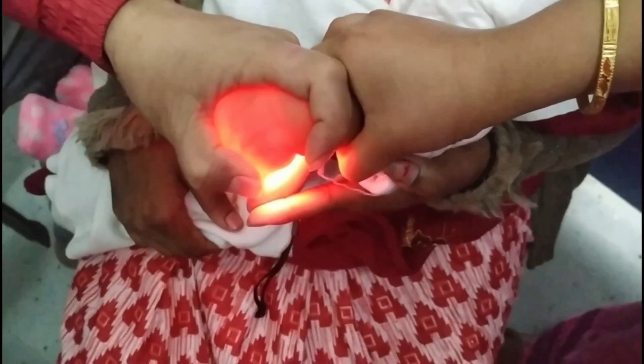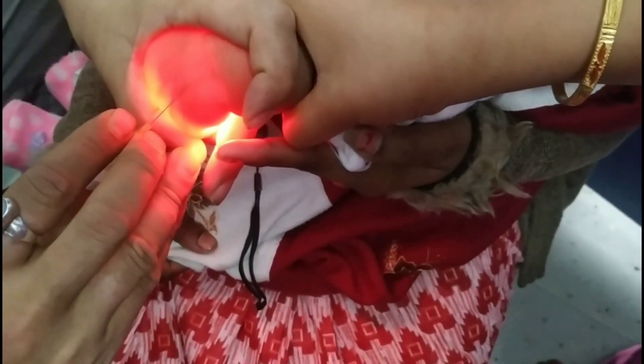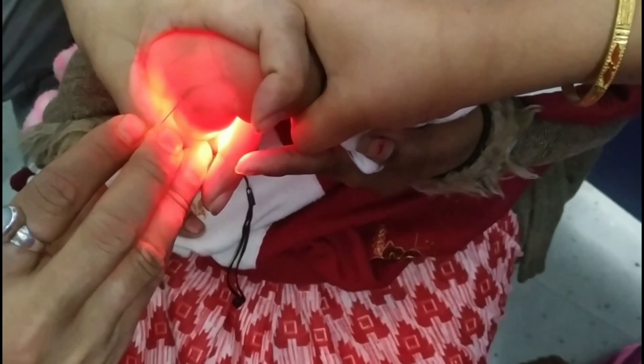It makes the vein more prominent so we can easily put the cannula needle into the vein and fix the cannula. I can show it practically.